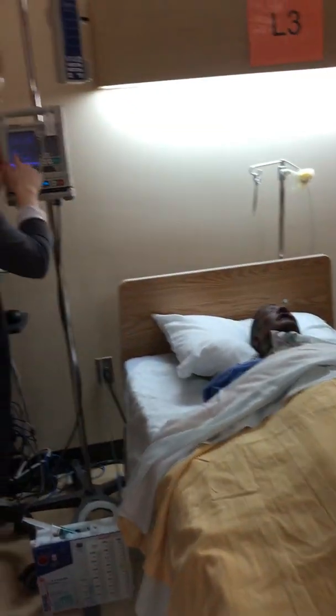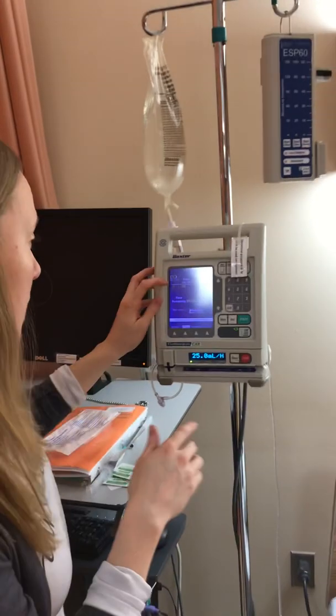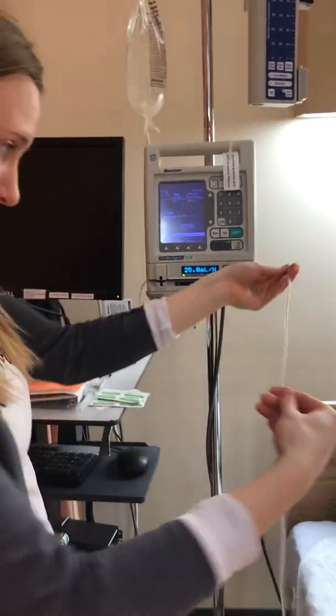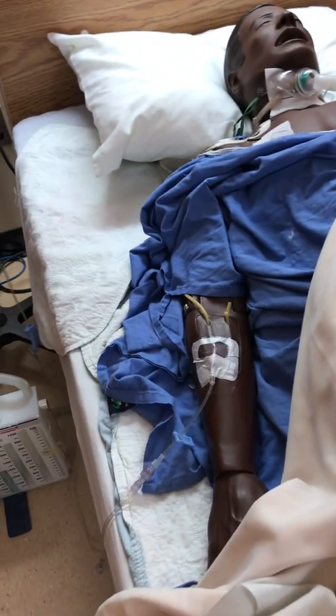I will check to make sure that this is running at the appropriate rate. It is running at the appropriate rate. It said 22, we're at like 25, so that's really close. The line is within the right amount of time, and I do not see any occlusion. This is open. I would also check the patient's wristband and compare it with my MAR.